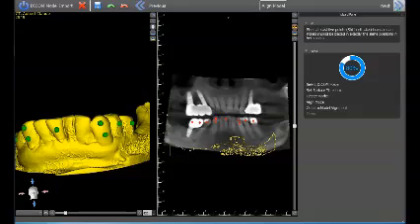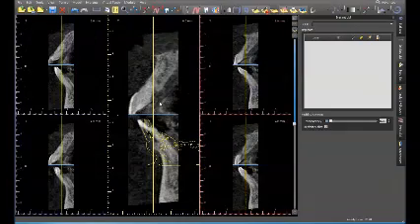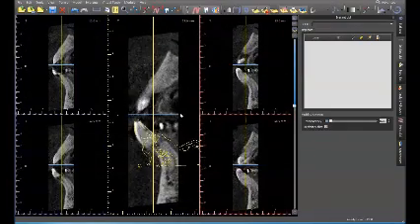And we're going to go into the next section. Let the computer try to stitch these two together, and then see what it comes out with. This will take a while for it to think. It'll usually show you this before you get into the next screen. And in here, what I'll usually do is run this section, see how accurate I am.